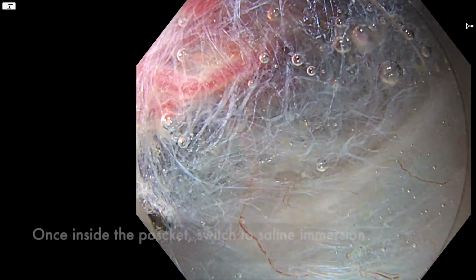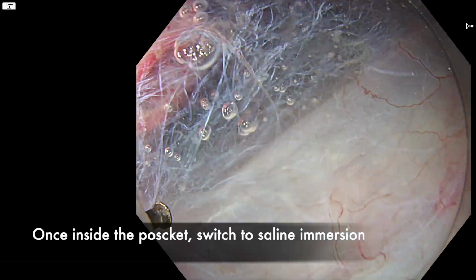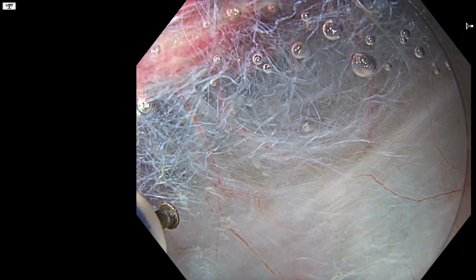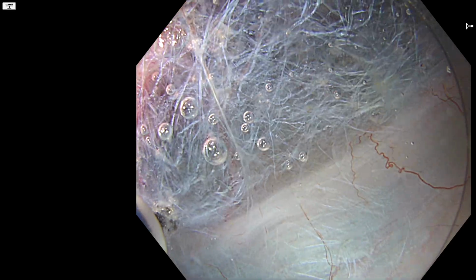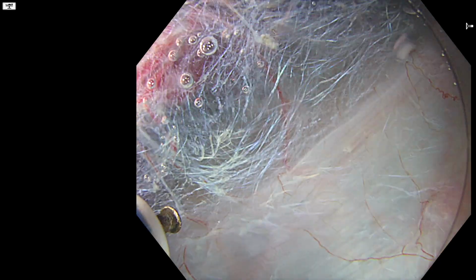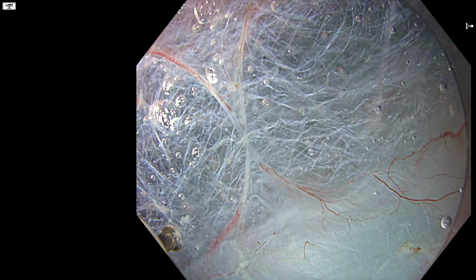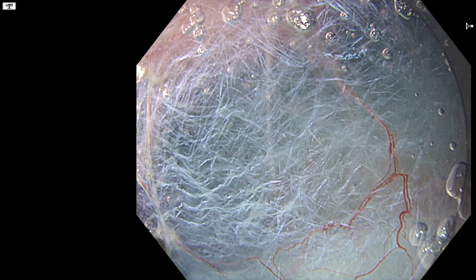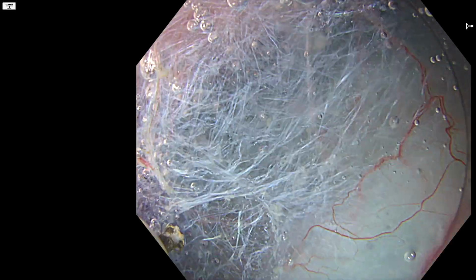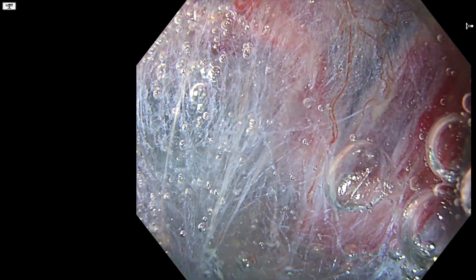So I've now fast forwarded to inside the pocket, and we've switched to saline immersion or sight. Now, if you've watched any of my other videos, you'll probably know that this is my go-to technique. And as I've explained before, the main advantages are the optical magnification, the absence of fogging, which means you don't have to keep bringing the scope out and cleaning the lens. And then there's also the stability and the natural traction provided by the buoyancy of the lesion.